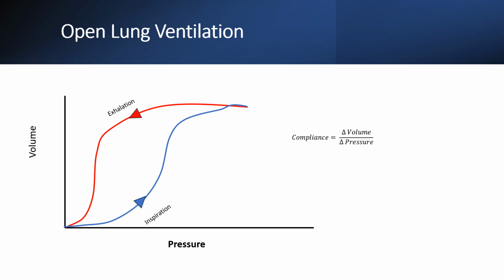This occurs when ventilation is inadequately low, or the mean airway pressure is below the critical opening pressure. The critical opening pressure or lower inflection occurs when there is a drastic change in slope of the inspiratory limb of the loop. This point reflects when there is a rise in the number of alveoli being ventilated. It also shows the point at which the minimum amount of pressure required to inflate the alveoli is surpassed. If too little pressure is applied, the alveoli may partially or completely collapse.